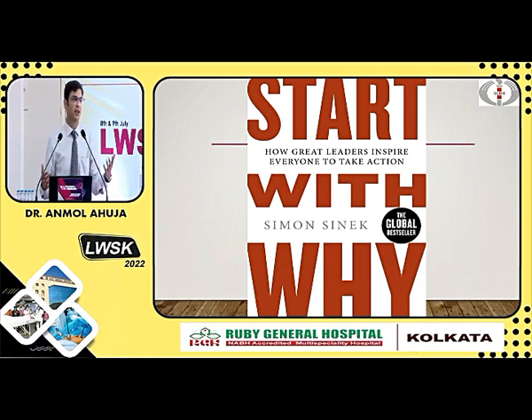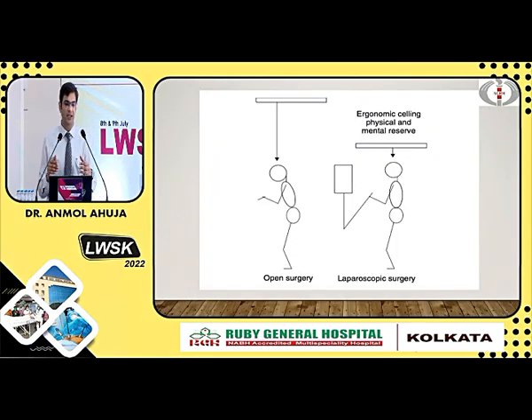Now, why are we talking about this? When we were trained for open surgeries, I think we never talked about this topic. There was no discussion on ergonomics when we were getting trained for open surgeries. But why are we talking about it today in laparoscopic surgery? Because of this difference. In open surgery, you are standing with your hands by your side, operating at your comfortable level. But in laparoscopic surgery, you need to accommodate. It is good that we stand straight, which is not so in open surgery, where your neck is bent down, which can lead to other problems.